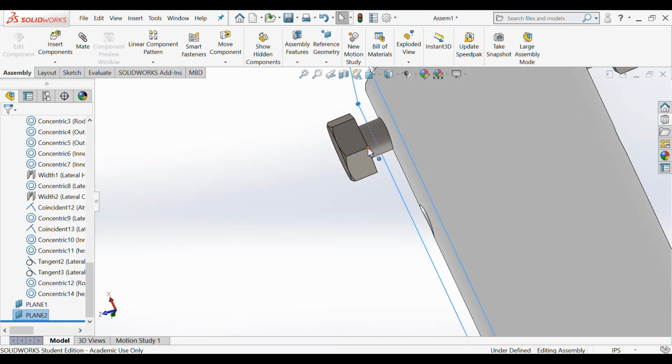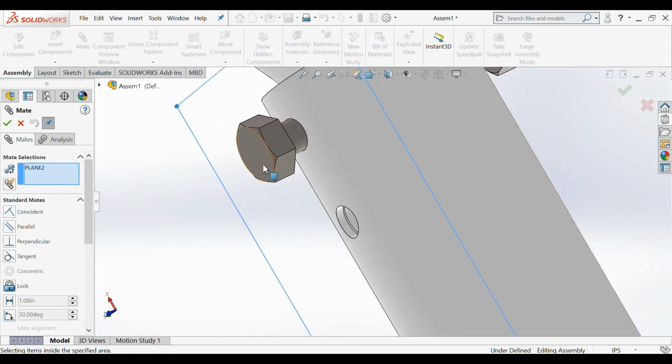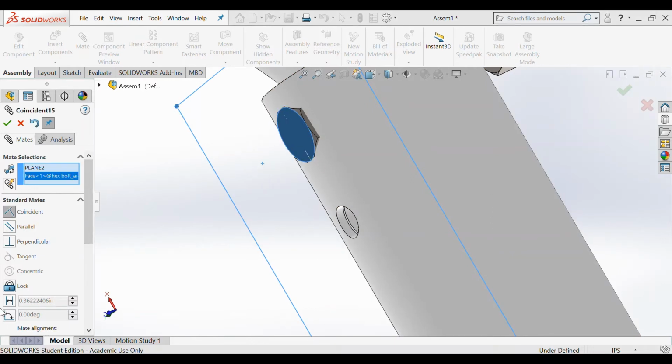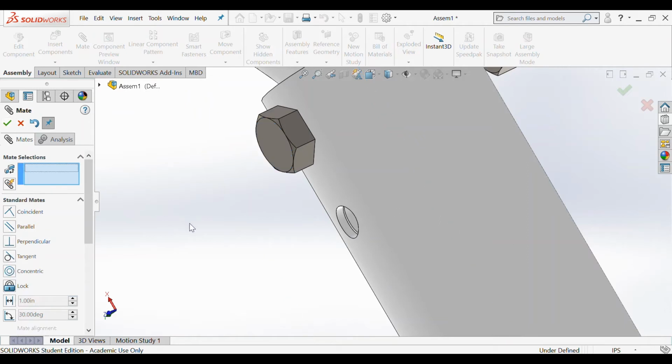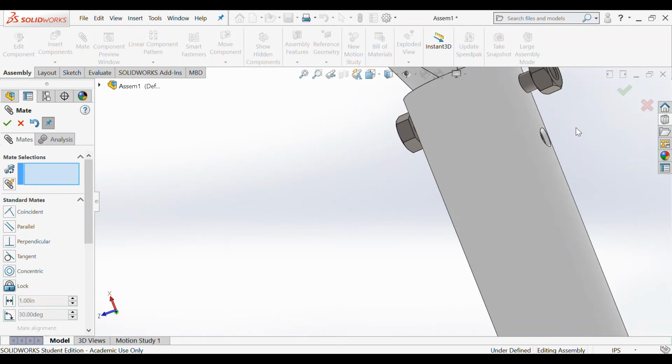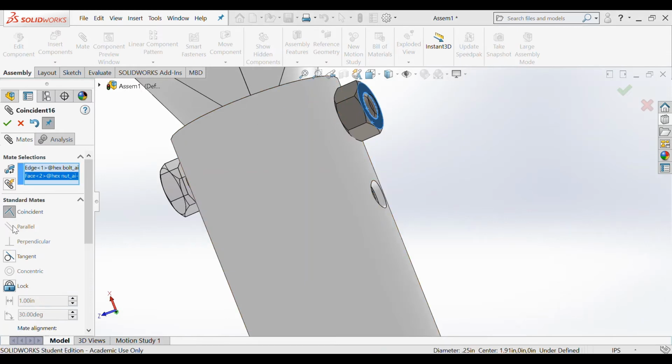So the distance from here to here, the thickness of the head of the bolt, is 0.19 inches. So I'm going to go on ahead and mate the plane 2, which is already selected for us, and the top surface of the bolt, and I'm going to choose the distance between the two to be 0.19 inches. I'm going to click the check mark, and now I'm going to move this guy. And what I want is this circle right here and this face to be coincident.